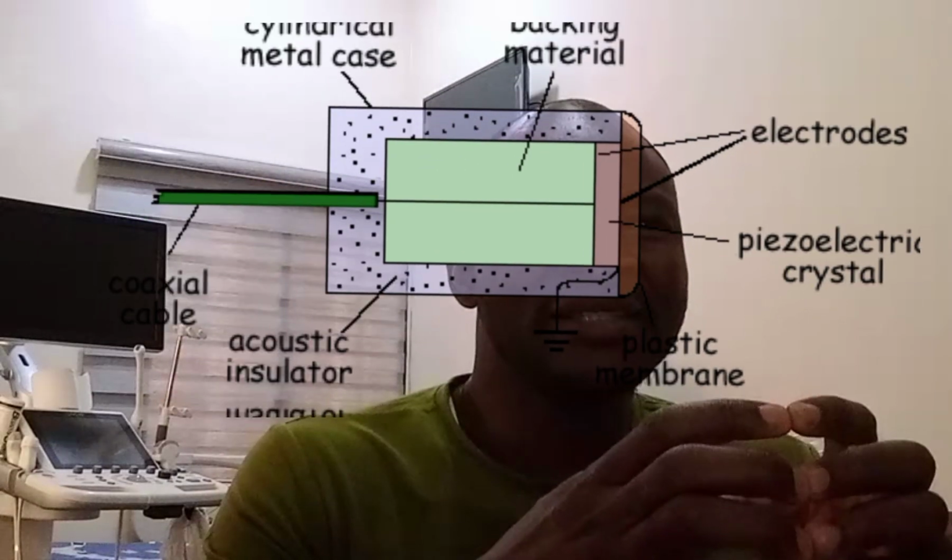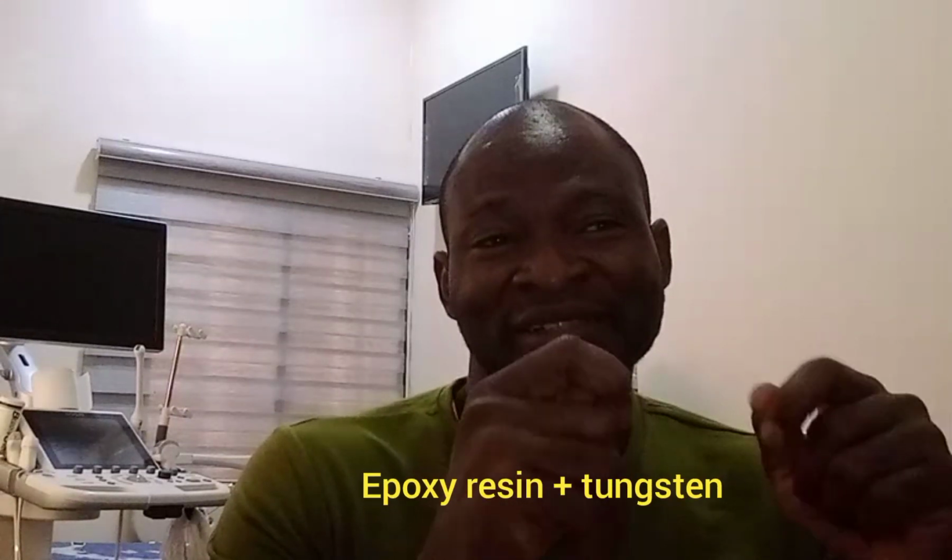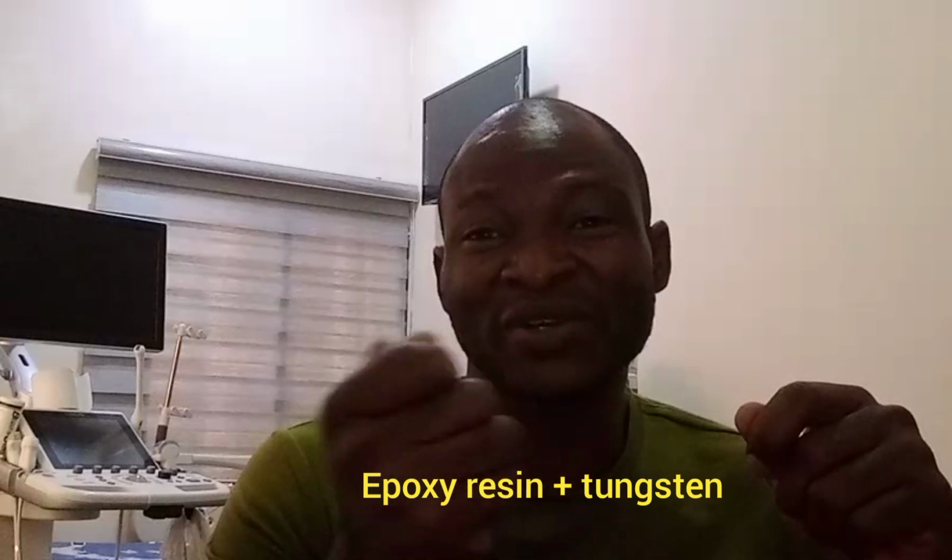So let's start with damping material, or what we call backing material. It is a material usually made up of plastic and metal powder. Actually, it's epoxy resin with tungsten, and is bonded to the back of the crystal. It acts to limit the ringing of the crystal by damping or absorbing the vibrations.